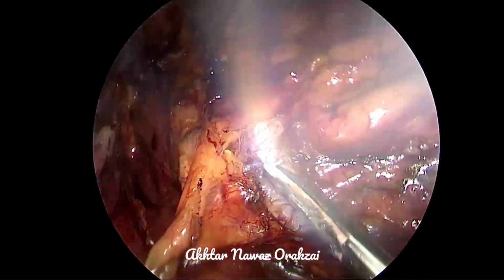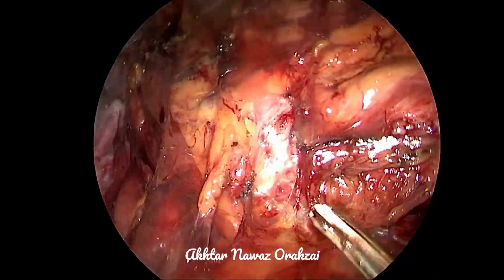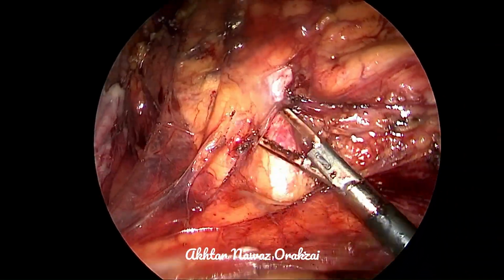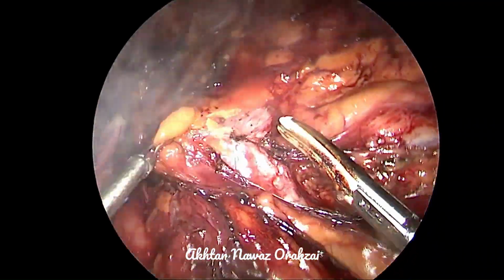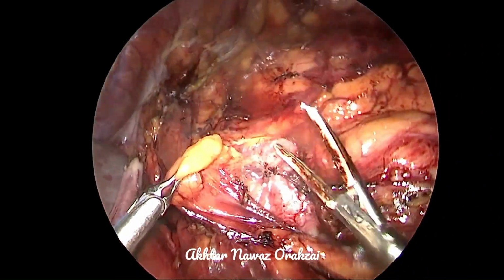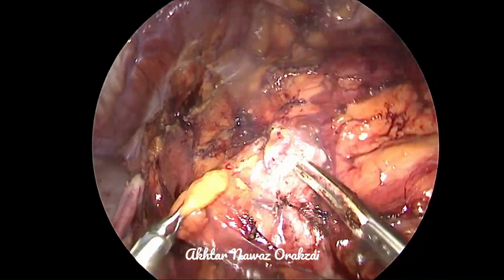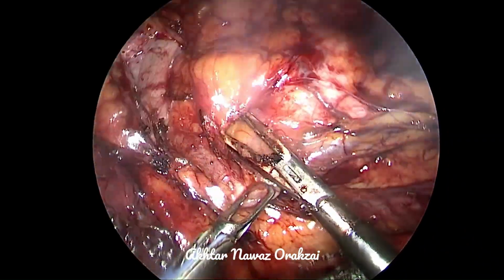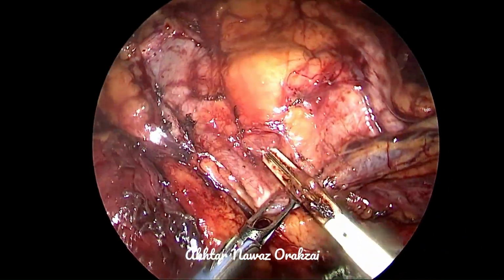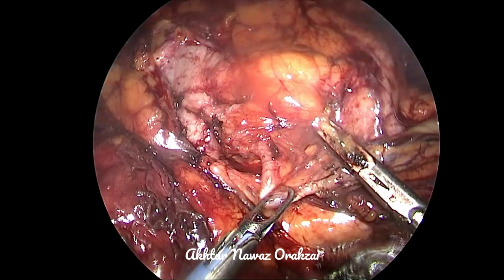We find the renal vein, and the patient is thin and lean. The kidney was grossly hydronephrotic, secondary to neglected PUJ obstruction. We decompressed the kidney, and we found a lot of space for ourselves. Now we are dissecting the gonadal vein.